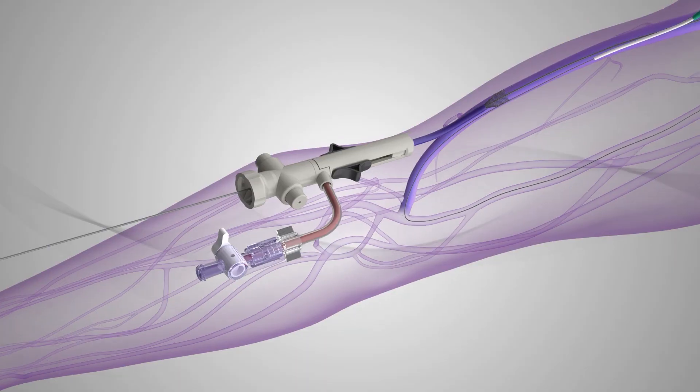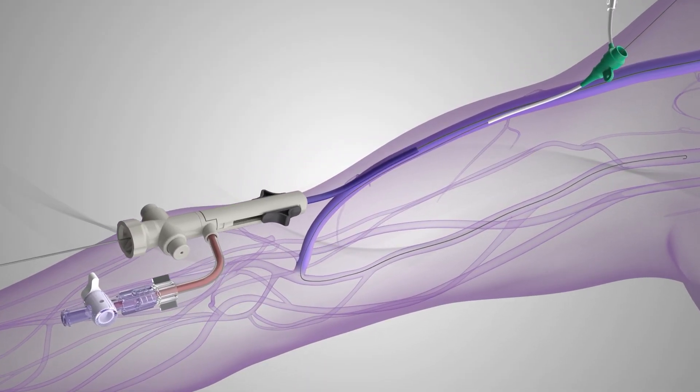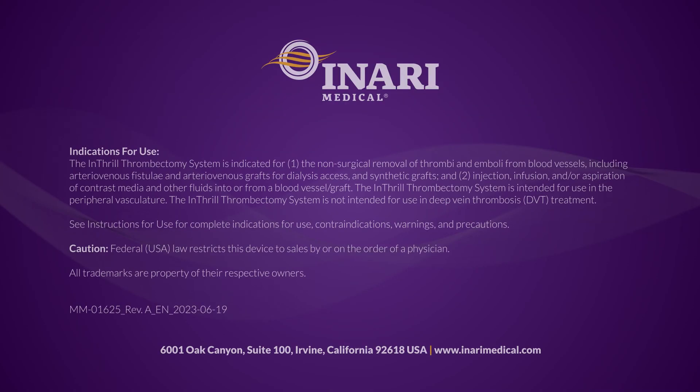Upon procedure completion, the Inthril sheath funnel is recaptured and removed from the patient. Closure is performed using standard techniques.